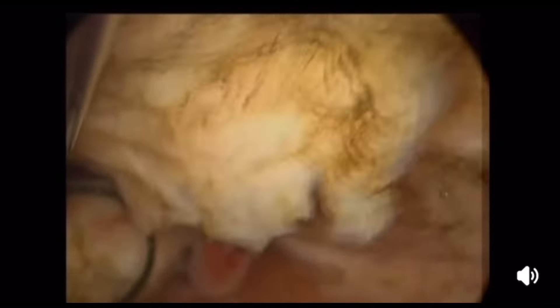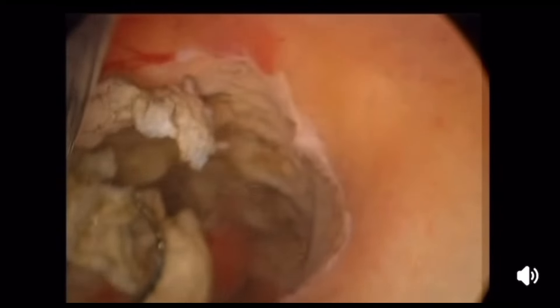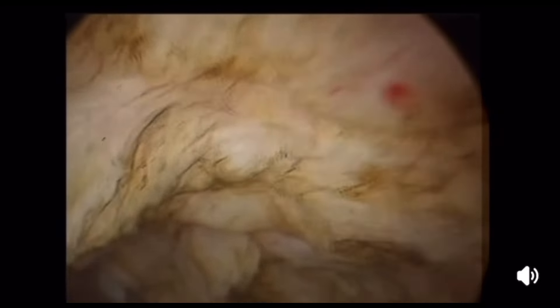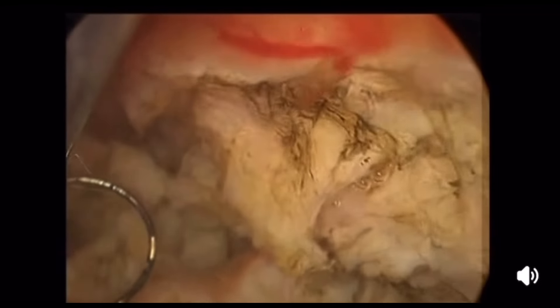The myoma is big — if you keep cutting into the same plane, you'll have a larger piece of the upper part of the myoma that will fall down and hide the view. I'm sharing with you the strategy: surgery is not skills of the hand at all, it's all about the mind and how you plan your strategy. After cutting on the inferior part of the myoma, going deep, I realized there is a bigger part above, so I started to move upward and to resect.